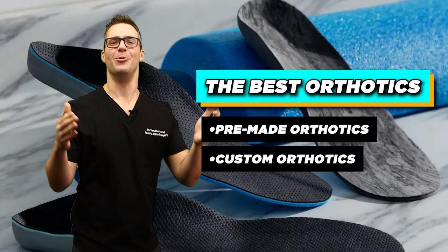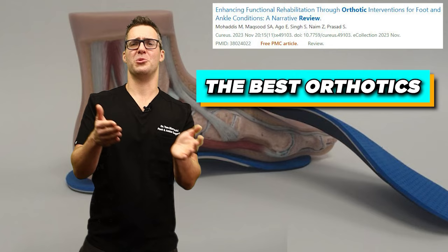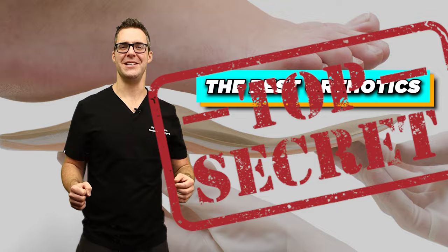This is Tom, and today I'm starting with orthotics — pre-made orthotics, custom orthotics — which ones are good? There are so many brands out there and they're expensive, ranging from $20 to $700. Which one should you get? Should you start with the $20 one or go with the more expensive one? We're going to go over all the studies. I've dispensed thousands of these and I'm going to tell you what works.